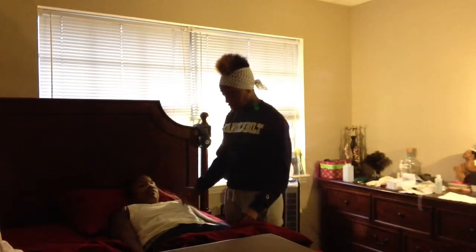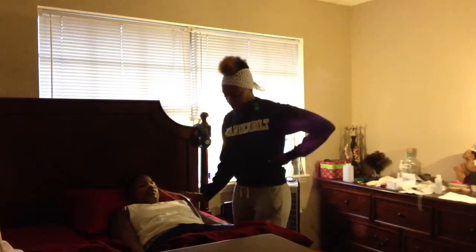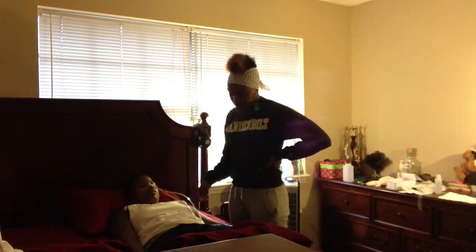I want to make sure that the tube is pinned to Ruby's gown. I want to lower Ruby down, and I also want to leave the call light next to her and raise the side rails.